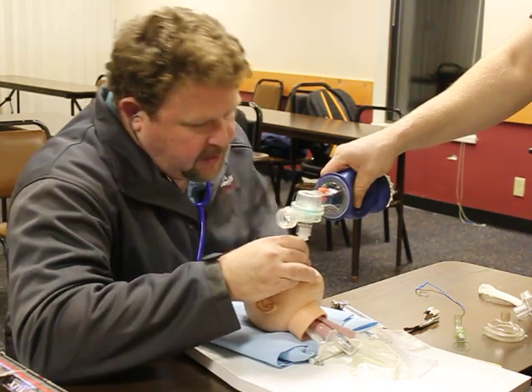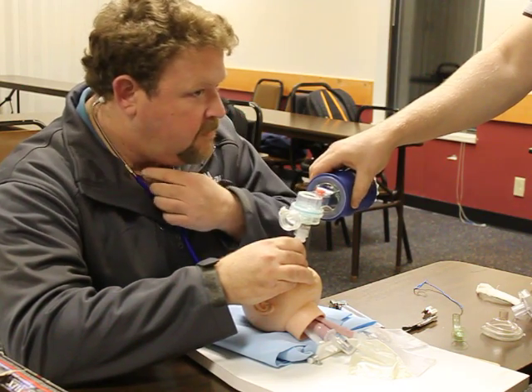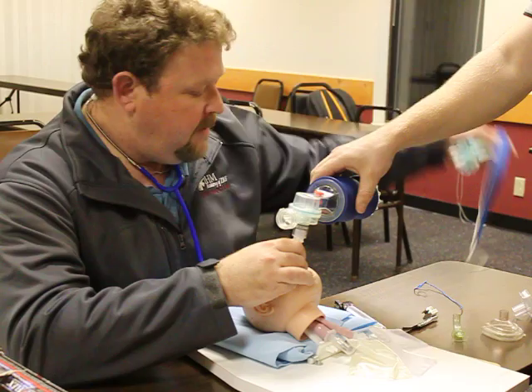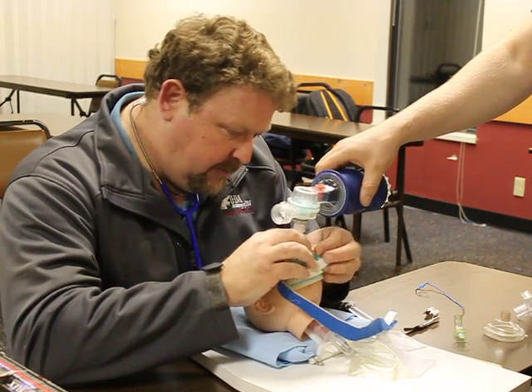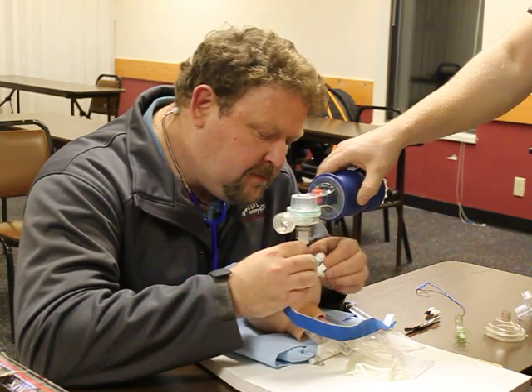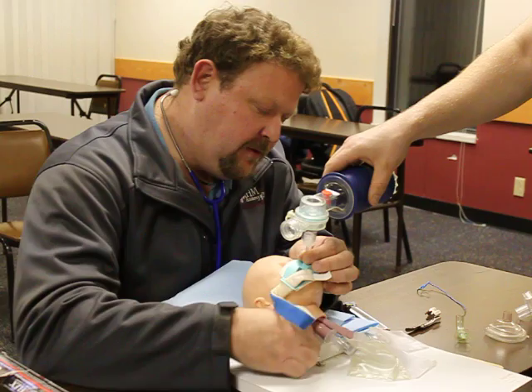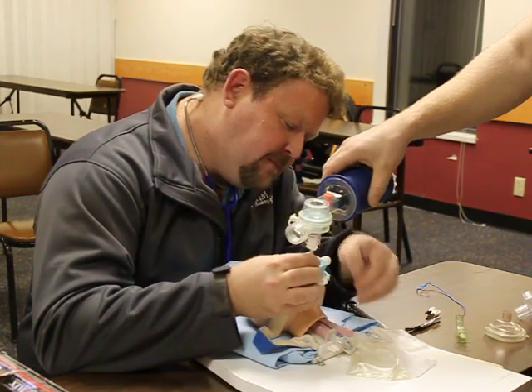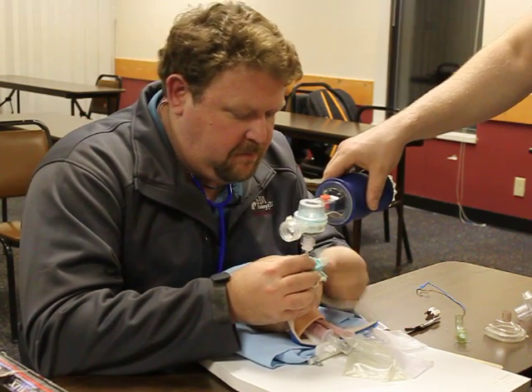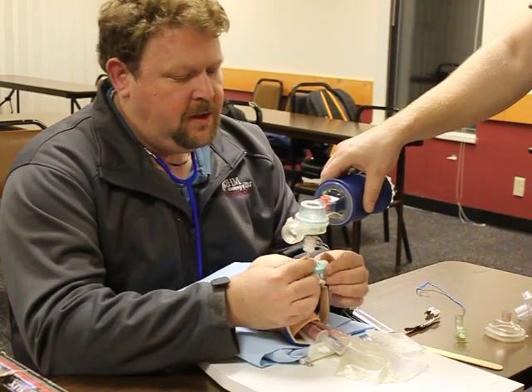At this point in time, I'm going to go ahead and auscultate the epigastrium and auscultate over the lungs bilaterally. If you had proper placement, what should you expect to hear? I should expect to hear no gurgling in the epigastrium and clear lung sounds bilaterally. I'm going to go ahead and secure my tube with a commercial securing device. I note that I'm at 10 centimeters at the lip. Without letting go of my tube — my tube is secure. I have tubed this patient.